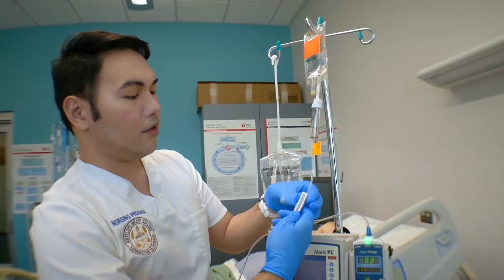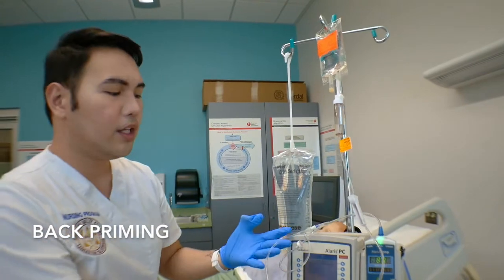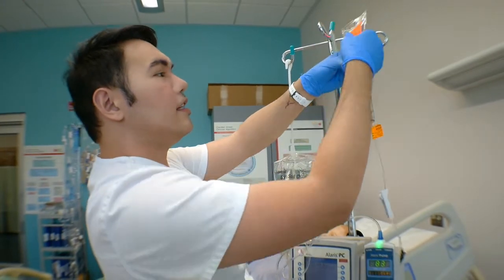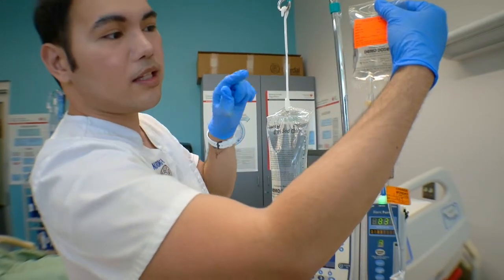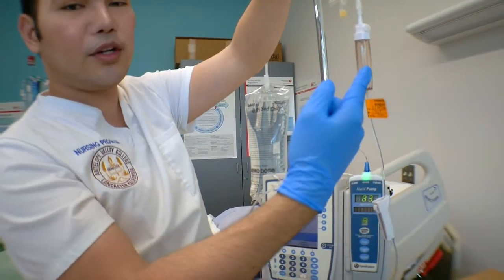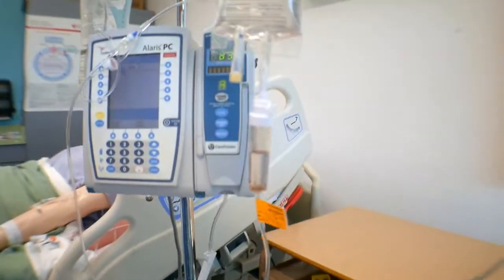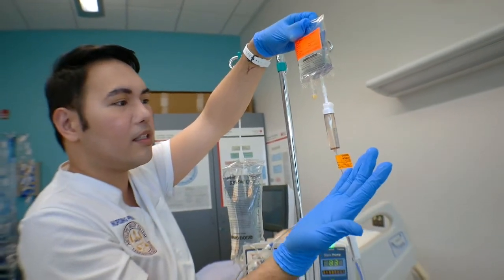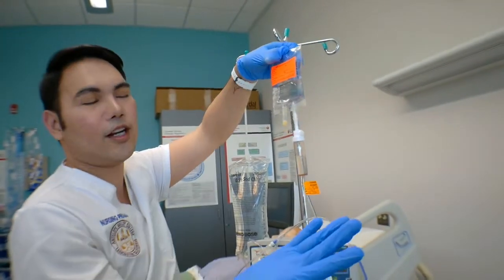So as I was saying, go ahead and clamp it. In any case you see any air on the line, we have this thing called back prime. So back priming is taking your secondary bag and putting it lower than your primary. So once I put this lower, you will see any bubbles that's stuck in your secondary go to your chamber. Okay. Since we don't have a lot of bubbles on the line, we're not gonna back prime it as much as we can because we want to make sure that the volume of your secondary stays accurate. Okay.